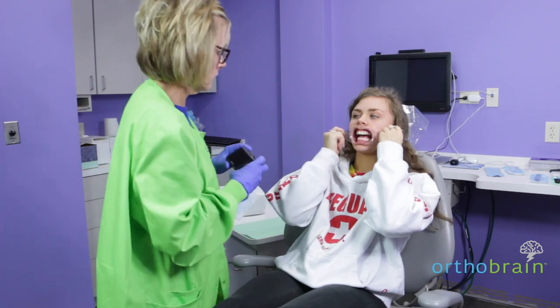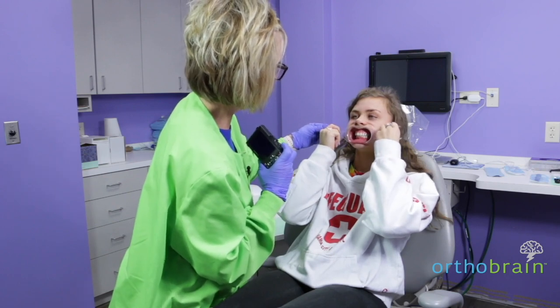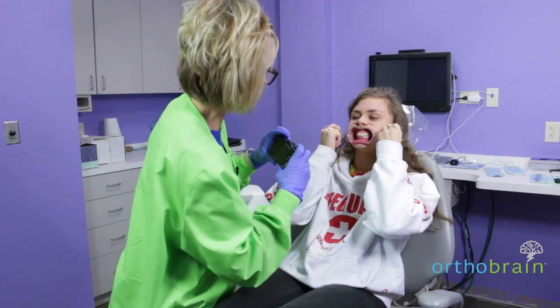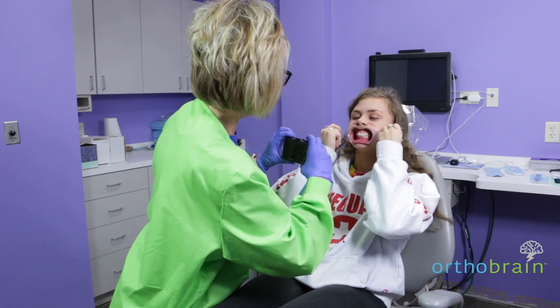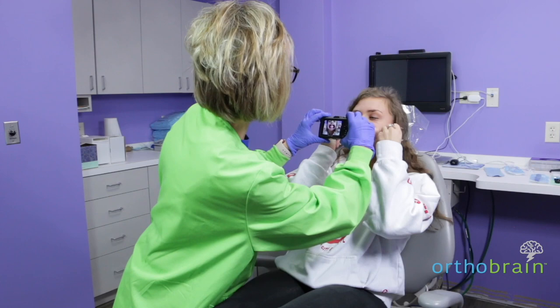Now, bite together and pull out on those for me on both sides and kind of tip them forward a little bit. It kind of lets you see the molars a little bit better, and approximately seven inches away.